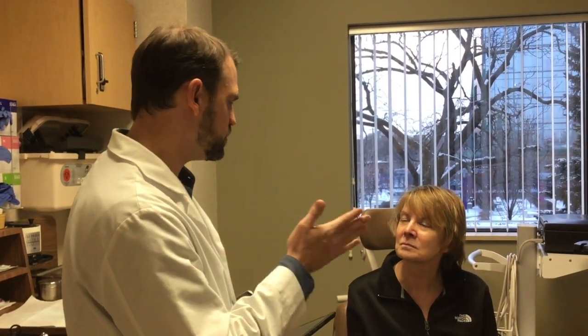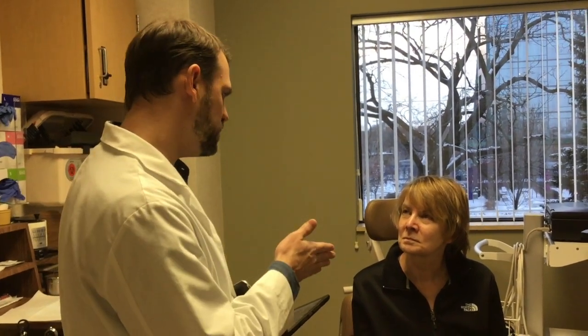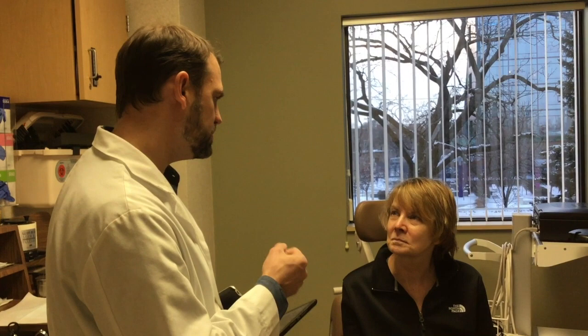So the septum was a little bit harder, you had to work a little harder. It's interesting because part of the septum is cartilage, and that part is easy to work with, but it's also floppy, so I was struggling with it. Whereas when I got back to the bony part, I just had to brute force break the bone there. It's weird to talk about, but for you, what was that like? Some pressure and maybe a little bit of pain here and there.